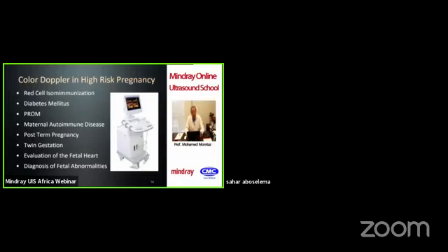In conclusion, the main focus of this lecture was on placental, umbilical, and uterine artery Doppler, but of course, you can use color flow in many, many things in obstetrics, and each of them would be like another presentation. The take-home message is, number one, don't be afraid to use Doppler. Doppler is very easy.